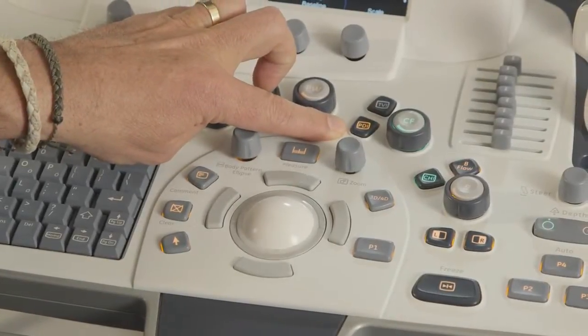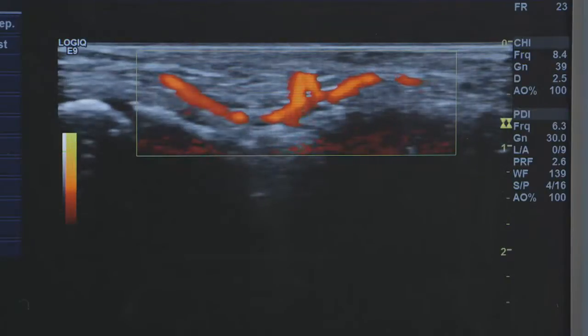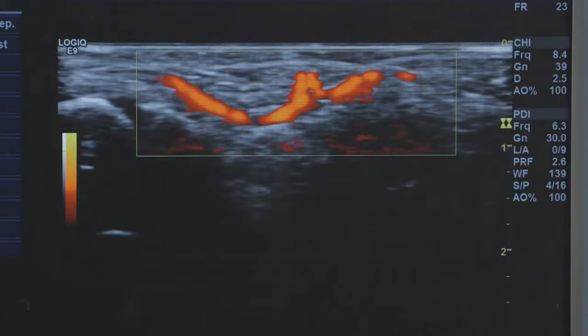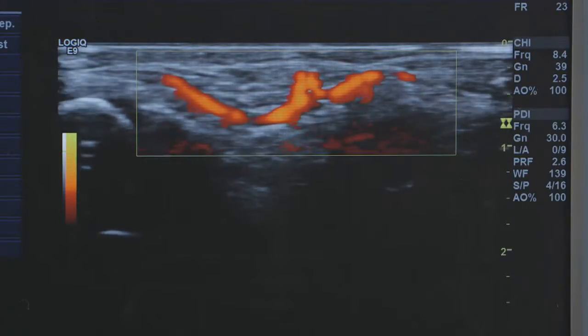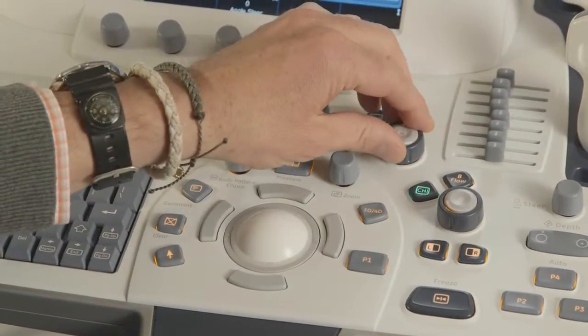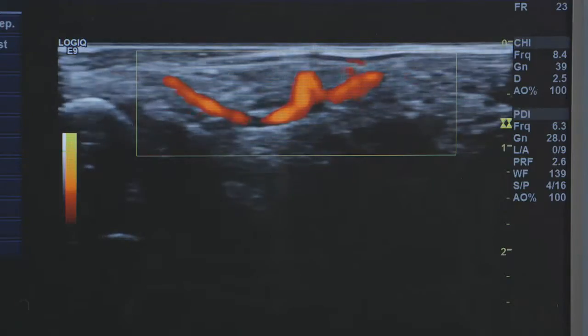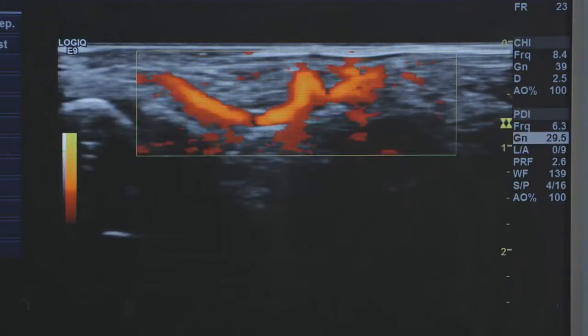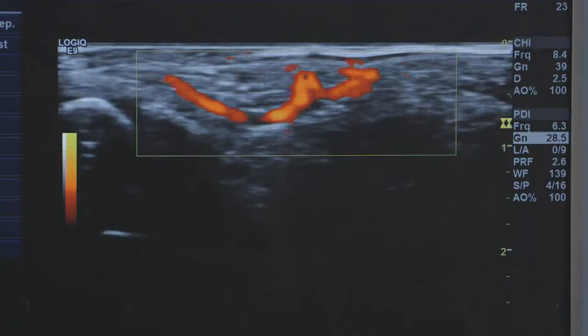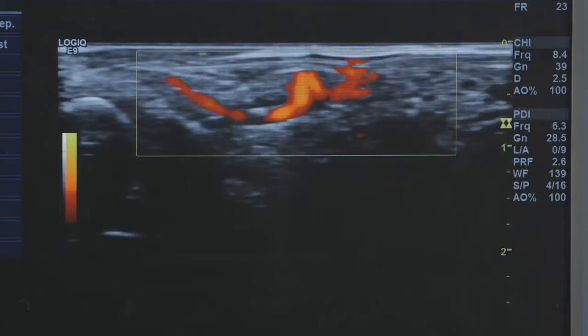Power Doppler imaging, or PDI, is a color flow mapping technique used to map the strength of the Doppler signal coming from the flow rather than from the frequency shift of the signal. Using this technique, the ultrasound system plots color flow based on the number of reflectors that are moving regardless of their velocity. PDI does not map velocity. Therefore, it is not subject to aliasing.